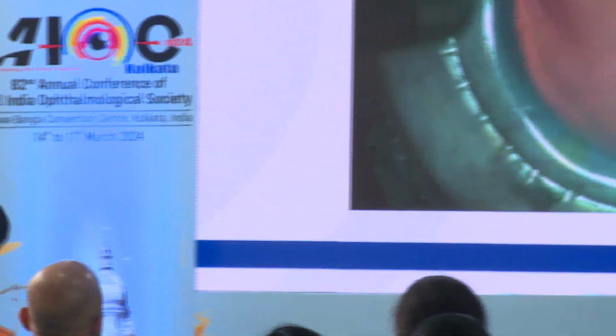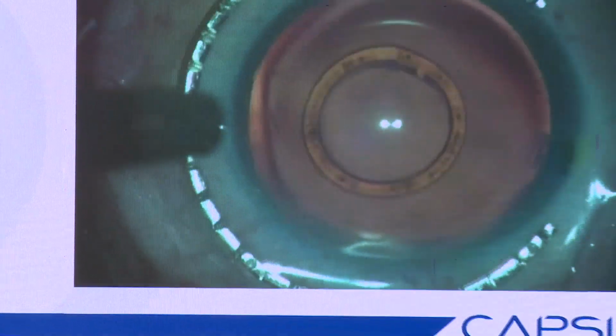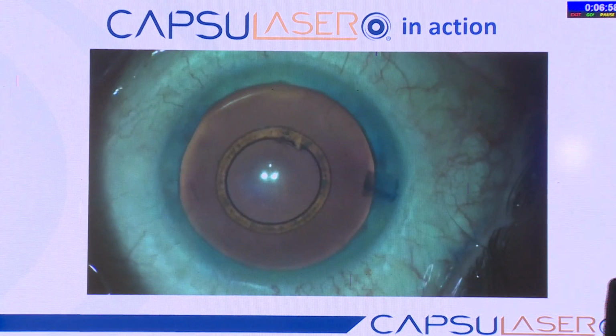This actually follows the experience of femtosecond cataract and basically looking for a more economical approach that could also provide benefits in complex cases and also just work with the workflow, so as not to take up so much space, resources, electricity, and everything else that we just heard about in the green revolution that we're all going to have to face. This is real time. These are capsulotomies that take a third of a second.